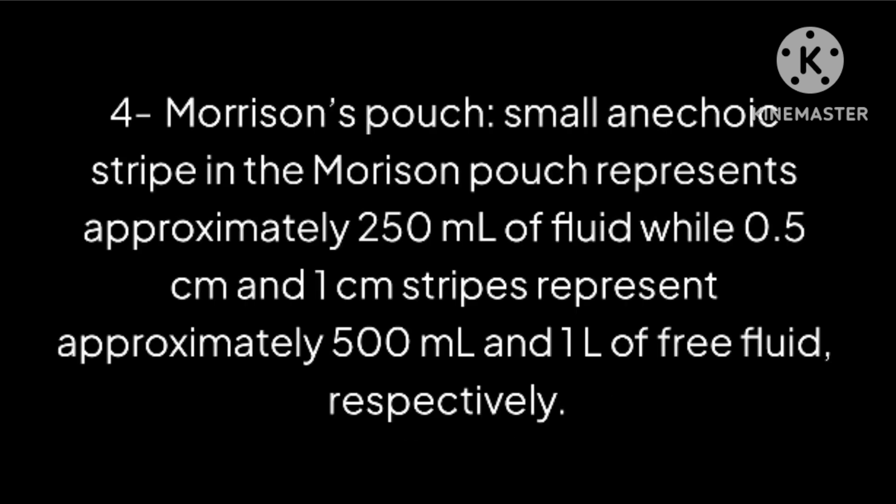Method 4: Morrison's Pouch. A small anechoic stripe in Morrison's pouch represents approximately 250 milliliters of fluid, while 0.5 centimeter and 1 centimeter stripes represent approximately 500 milliliters and 1 liter of free fluid respectively. Width of fluid in Morrison's pouch in centimeters multiplied by 1000 equals volume in cc.